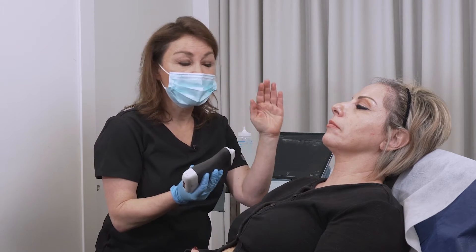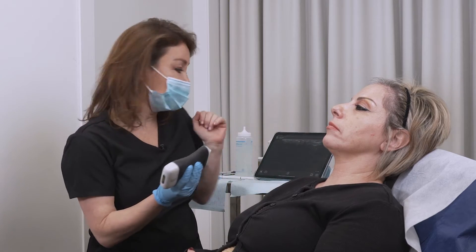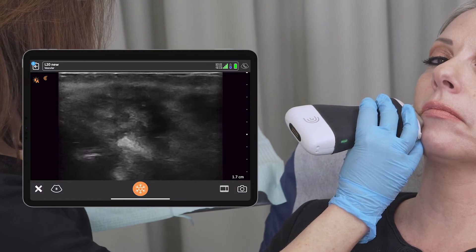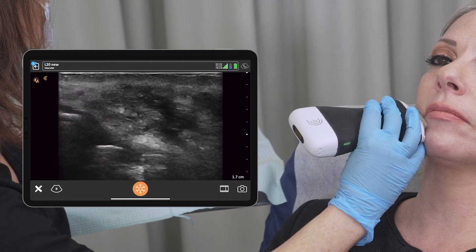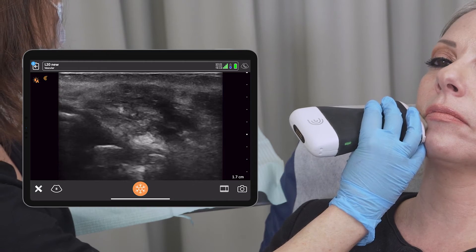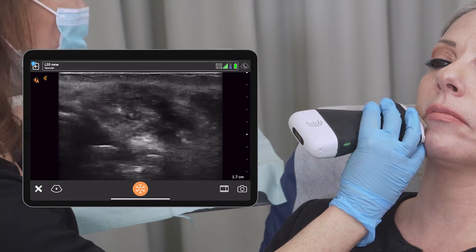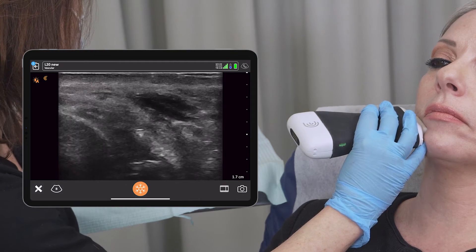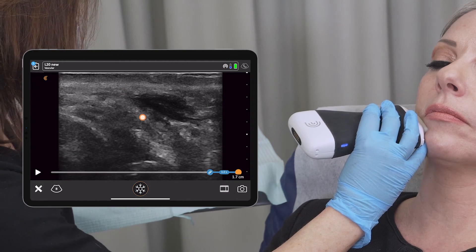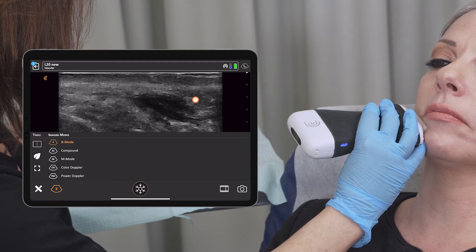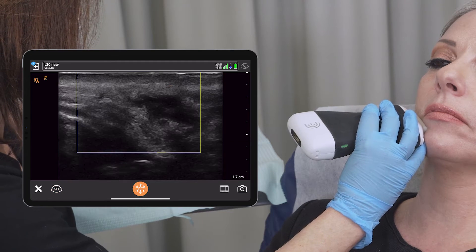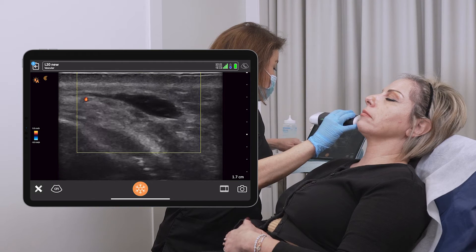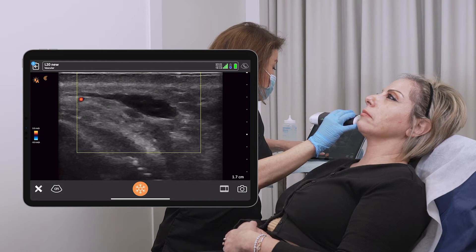On her right and left side, I'll go to the B-mode first. We can see there is some previous HA — some previous filler — already there. Now I'll go to the Doppler mode and try to find the inferior labial artery.